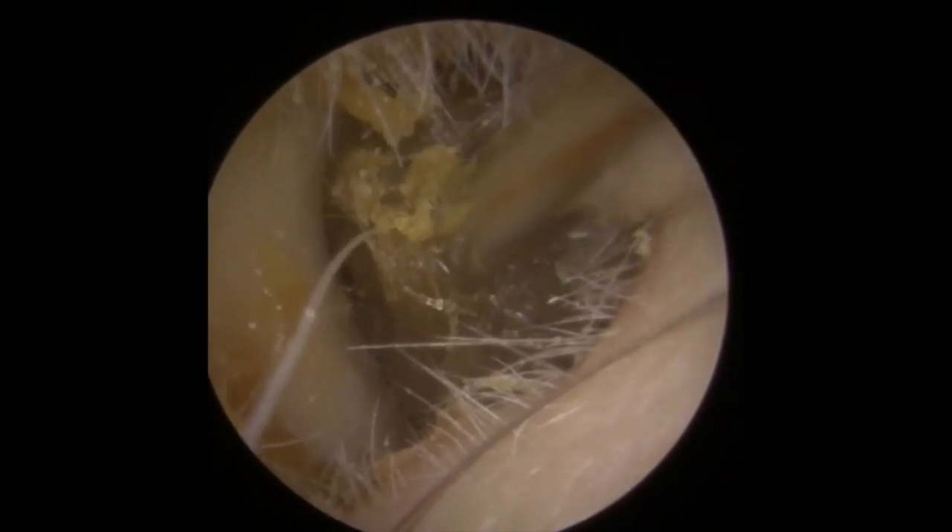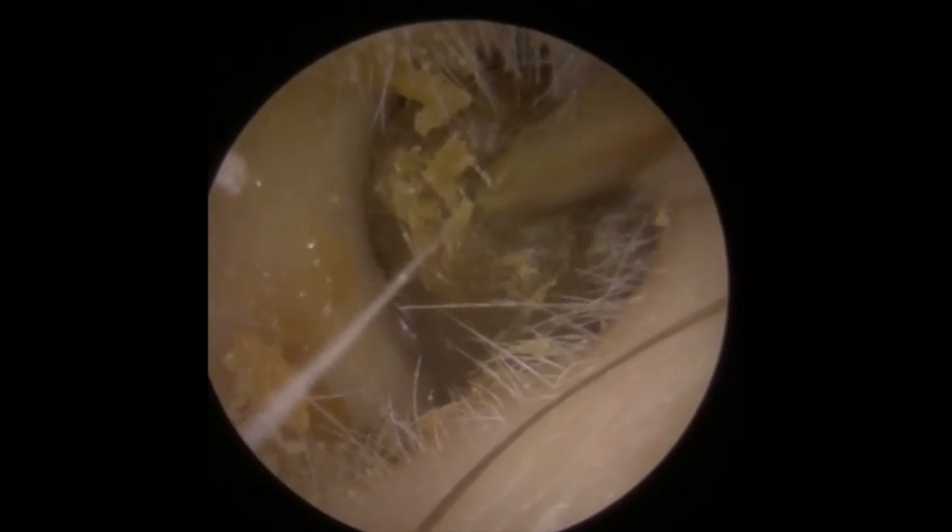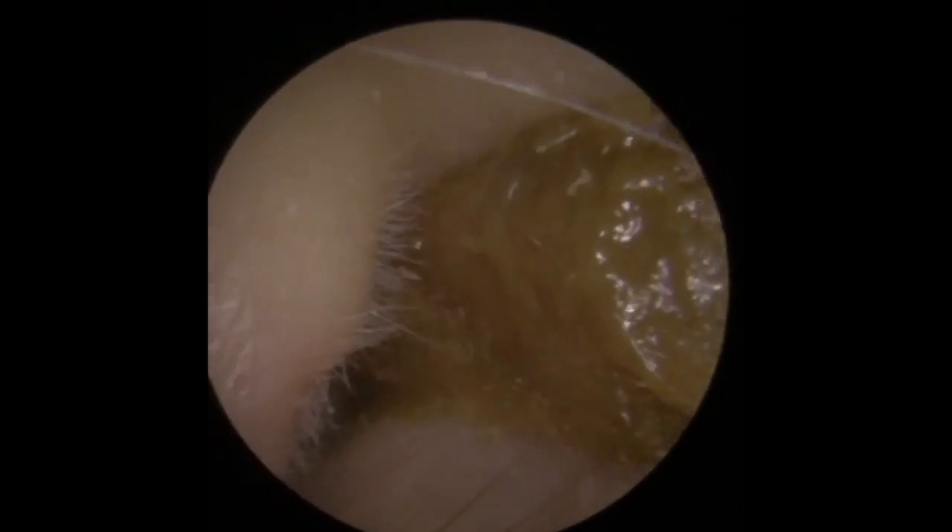You are just starting to see it move a little bit now, lifting from the base. You can see just how sticky it is — as we're lifting it from one corner, the top of the wax will stick to the opposite corner of the canal. Working its way out into the bowl of the canal there. Just keep wiggling this up and down, inching it forwards. We've got it into the bowl of the canal — that's the front end of the wax.